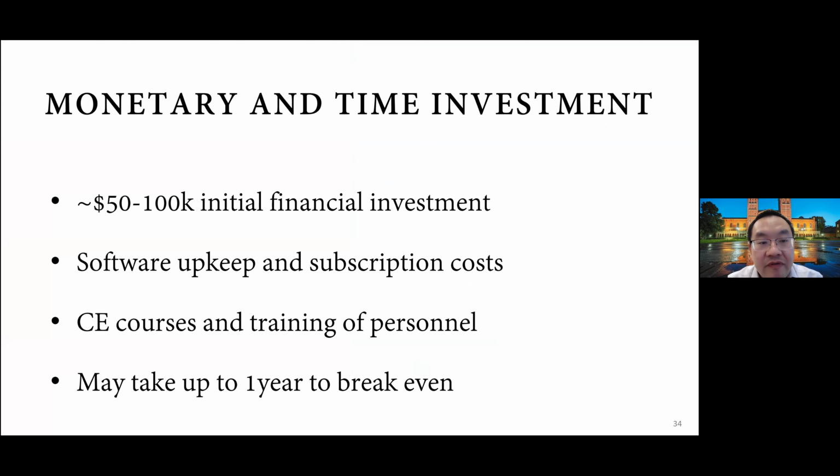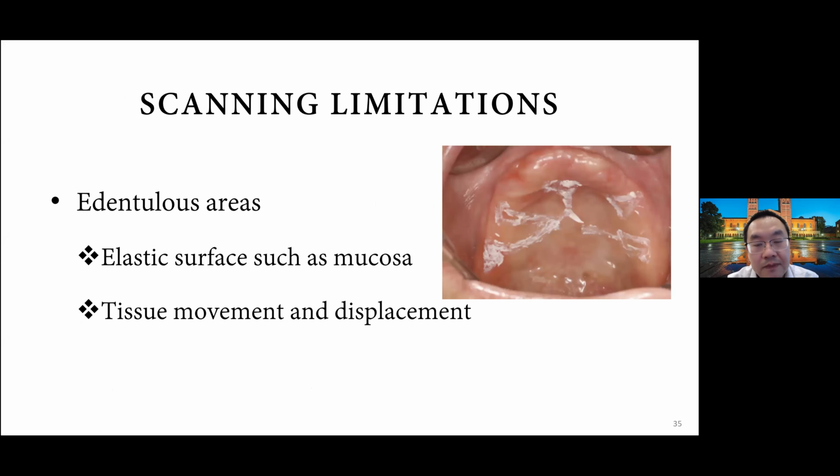So, monetary and time investment: 50 to 100K initial financial investment could be a lot if you're just starting off. Software upkeep and subscription costs, you have to look into that with your resellers and talk about that. It could add up too. CE courses and training of the personnel could be a financial and time investment as well. And it may take up to 1 year for you to break even before you start making any money back, right? Taking those into consideration. Now, scanning itself, as we talked about, is not necessarily there for every single case.